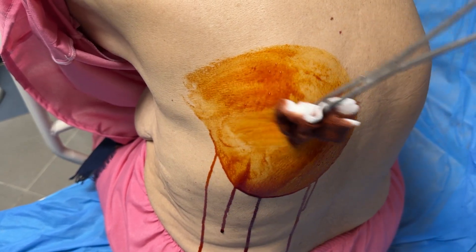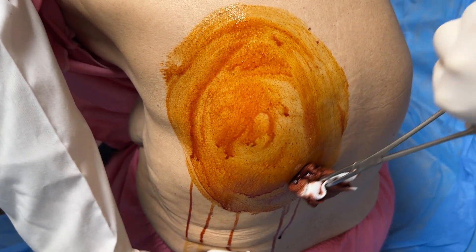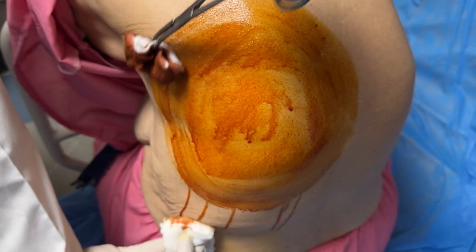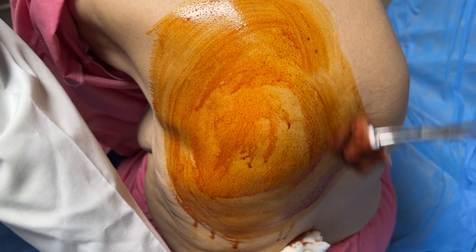First, position the patient upright, leaning slightly forward, allowing the diaphragm to descend and the pleural fluid to collect dependably. This position opens our acoustic window for ultrasound guidance when it's needed.